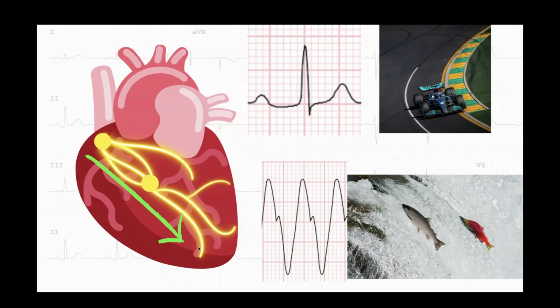And that's because if this little heart cell here, or this little cluster here, in the ventricles starts firing, going rogue, becoming irritated, ischemic, irritable, and it starts generating their own automaticity or automatic impulses, and they're making now VTAC and they're taking over, they're going against that normal vector. So they're an absolute right axis. They're going against the normal flow. So it's like swimming up Niagara Falls or swimming up creek or off-roading on a back road. It's not efficient, so it takes more time.